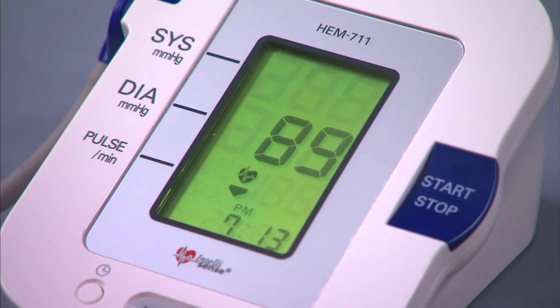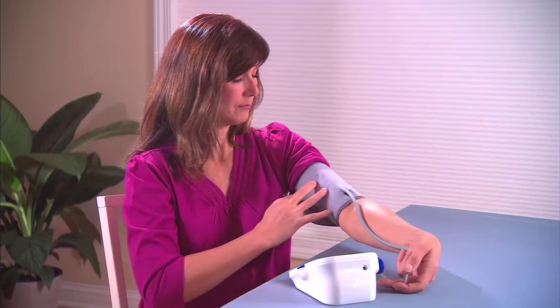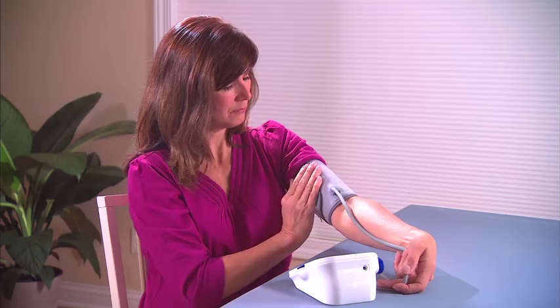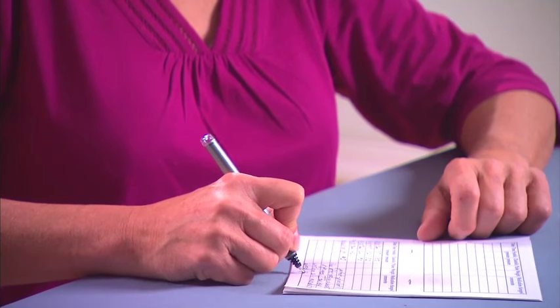When the reading is complete, the monitor displays your blood pressure and pulse on the digital panel. If the monitor doesn't record a reading, reposition the cuff and try again. Rest quietly and wait about 1 to 2 minutes before taking another measurement. Record your numbers either by writing the information down or by entering the information into an electronic personal health record. Some monitors can upload your blood pressure readings automatically.